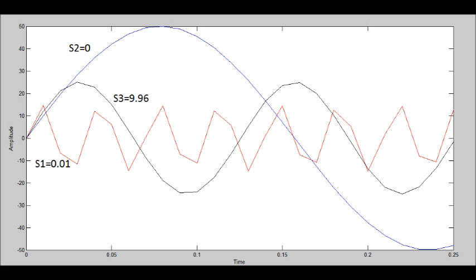So what we have here in this graph is we've inputted 3 types of sinusoids to kind of replicate EEG data. And so the first one has an S1 of 0.01, and so that means it's kind of likely that a seizure might have occurred. And you can see that it has a pretty high frequency while being low magnitude, and that combination means that a seizure may have occurred, but more likely not.